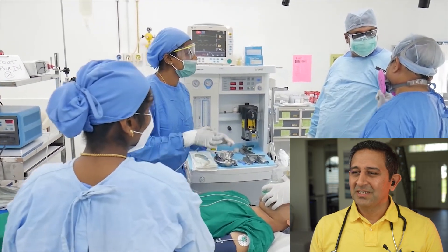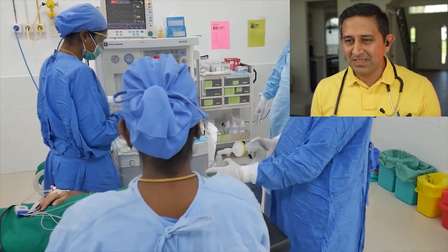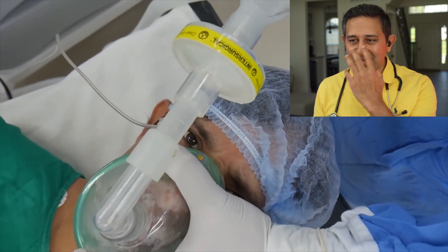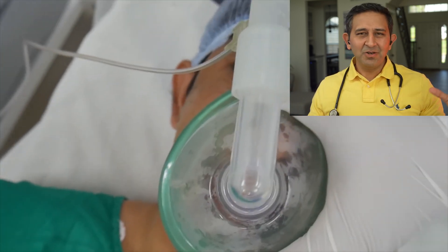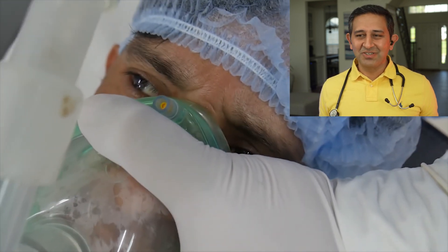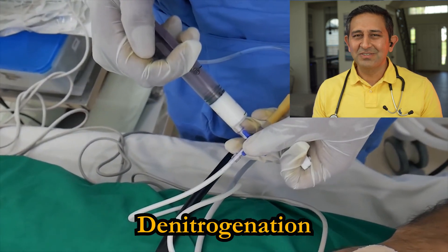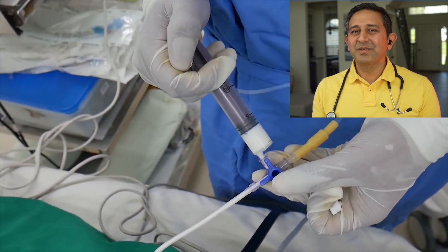I see two people standing at the head of the patient. This patient already has an IV on the right arm — propofol through the IV to get the patient off to sleep while the mask is being held on the face to give oxygen. This oxygen is important because normally room air has mostly nitrogen, and during anesthesia all the nitrogen has to be washed out by giving an oxygen mask. This is called denitrogenation and it helps to keep the patient safe.